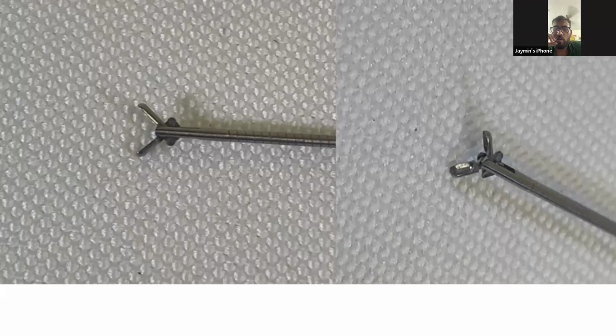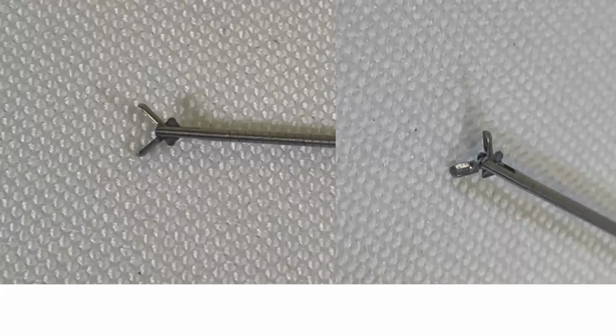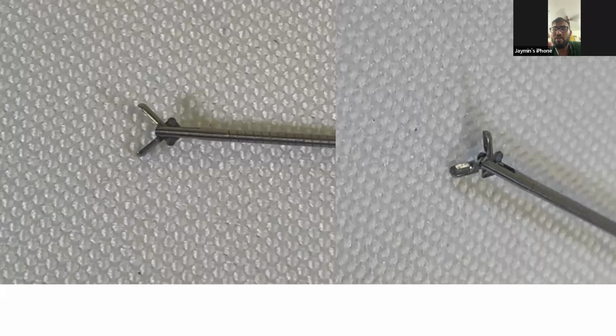So this has a cup as in the forceps and the ends, the prongs. It has a cup shape, so whatever lesion we are trying to biopsy, it will grasp it. Whereas the biprong forceps or the grasping forceps has serration, for a better firm grip of a stent to hold that. That is the basic difference. And this is a rigid; that was the flexible one, sir.